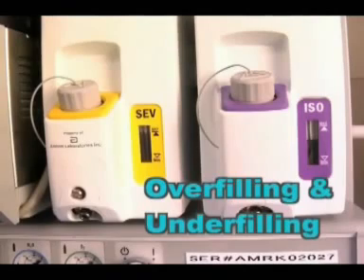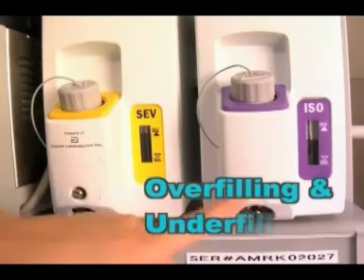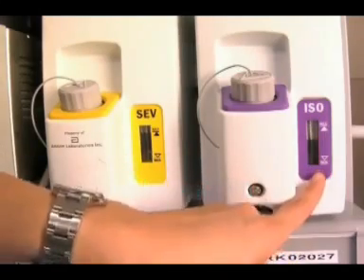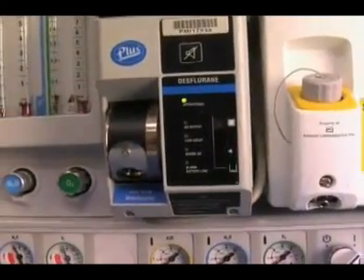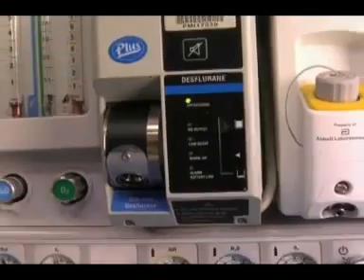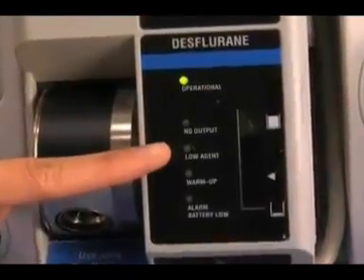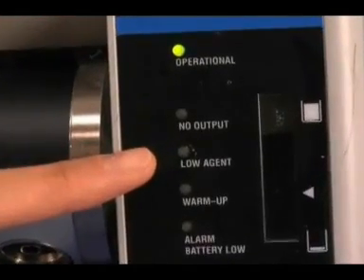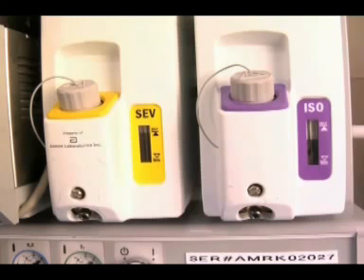Overfilling and underfilling. Improper filling procedures can cause patient overdose or a fall in vaporizer output. Most modern vaporizers are now equipped with side fill rather than top fill designs, which largely prevents overfilling. The Desflurane vaporizer has a low agent indicator that comes on if the volume of liquid agent is less than 60 milliliters. The sevoflurane and isoflurane vaporizers do not have a low agent indicator. Therefore, it is important to keep a close eye on the levels.